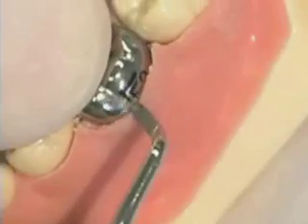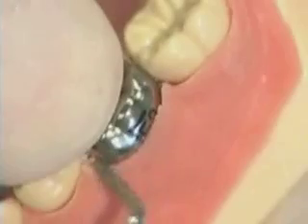We use a heatless stone to shorten the crown. Hold the handpiece so you can see where the scratch line is. The proximal reduction is a line that connects the buccal and lingual lines and rises up in the proximal space. Inside the crown, the heatless stone leaves a burr that can only be removed with a spoon excavator — just scrape the burr out and remove the residual stainless steel forced internal to the crown. Return to the typodont for another seating and a second scoring of the free gingival margin. Repeat this until the line doesn't change, continuing with shortening the margins and removing the burr with the large spoon excavator.